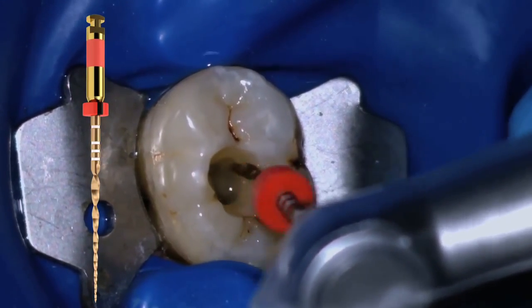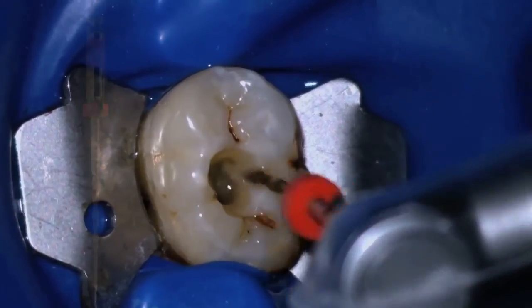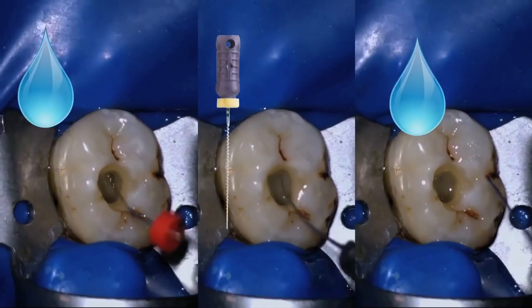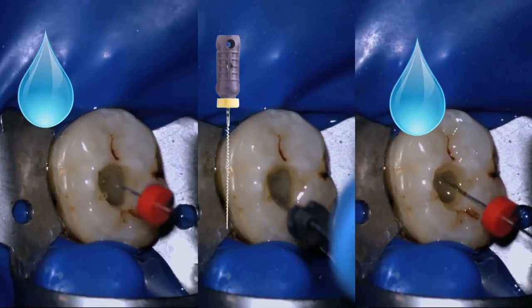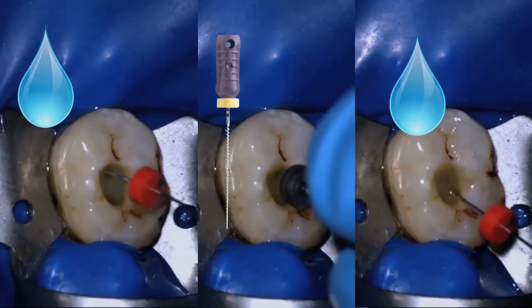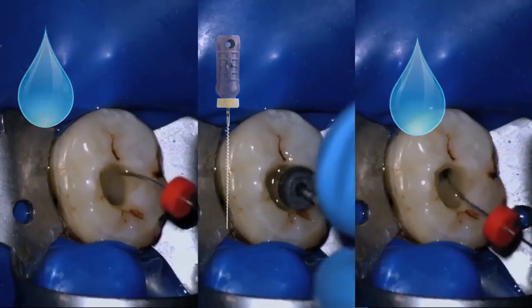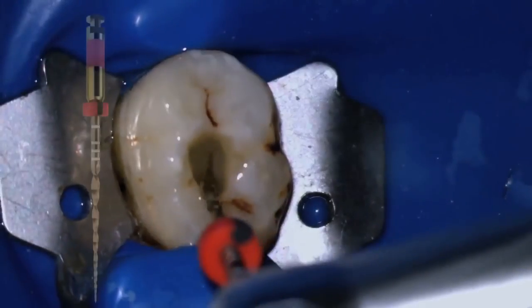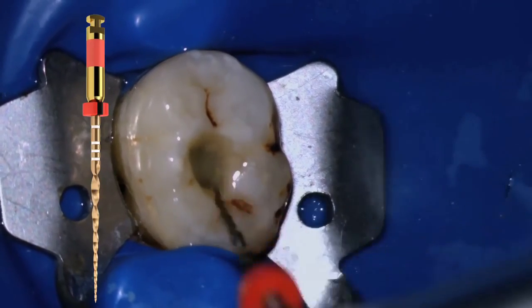And then we use WaveOne Gold in amplitude strokes of 3 millimeters inside the canal. We can see on the left that we are irrigating. We see very clearly in the center that we're making sure that the canal is still patent. And after a file comes out of the canal, more irrigation is required. Then we continue with WaveOne Gold for the second time.